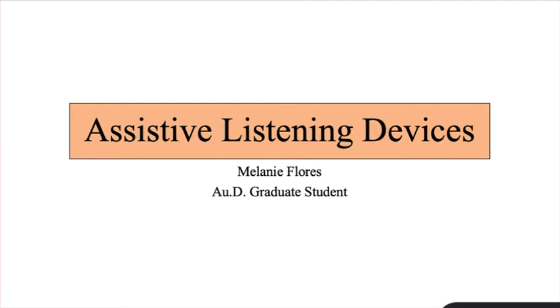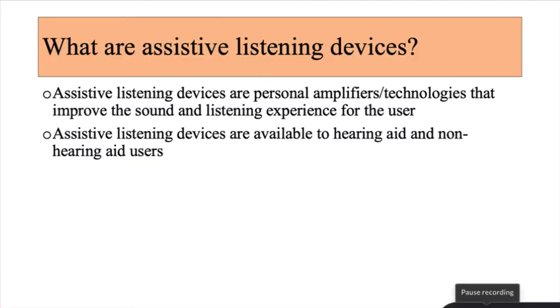And in this video, I'm going to be giving a brief overview of the assistive listening devices available to the public. What are assistive listening devices? Assistive listening devices are personal amplifiers or technologies that improve the sound and listening experience for the user. And importantly, there are assistive listening devices available to both hearing aid and non-hearing aid users.